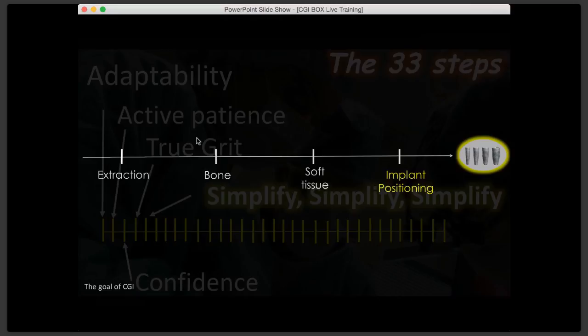It just takes longer. Some of those crowns are zirconia and metal. You have to go through multiple burrs. It takes time, lots of drilling. I would use a universal forceps first, and probably over 50% of all times, maybe close to 70%, the crown will just come off. It'll come off.